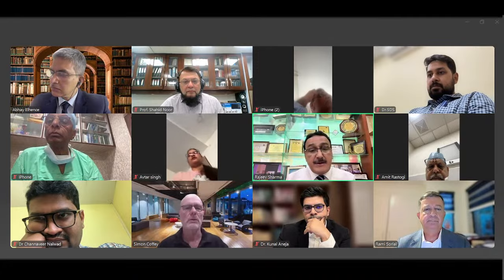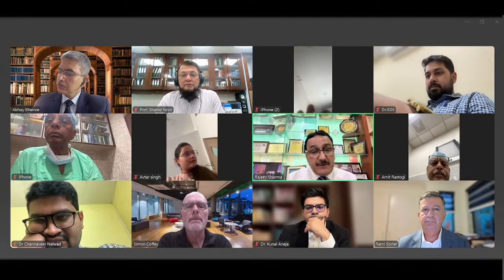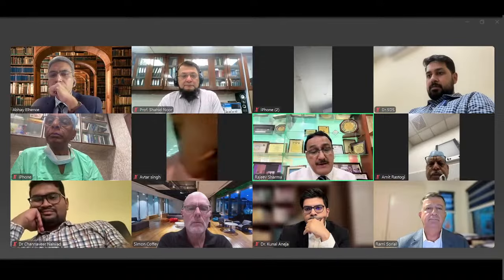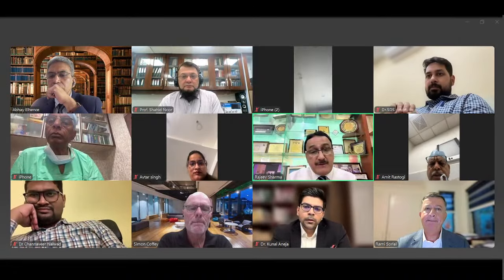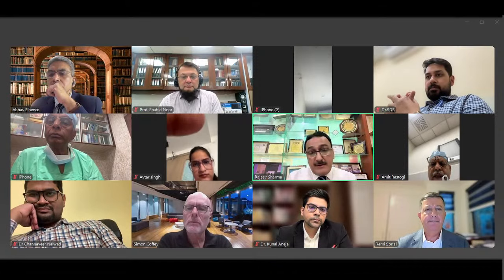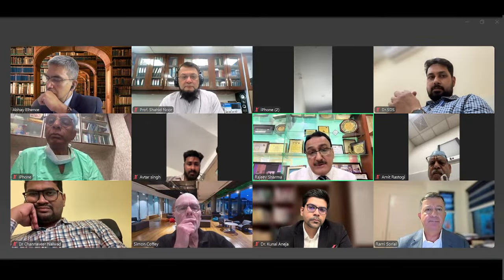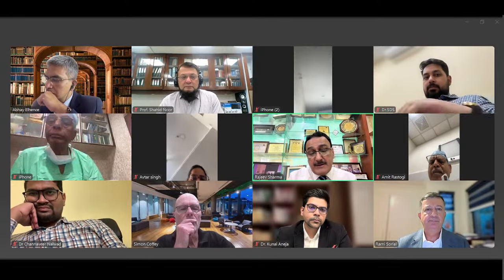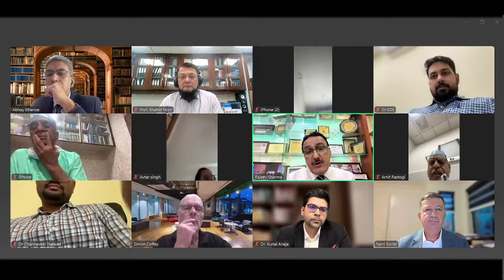Simon, that's a very important thing. We have been assessing and seeing the femoral offset frequently and measuring it up. The acetabular offset assessment is slightly more tricky because you need to have an assessment preoperatively, and perioperatively you need to have in mind the preoperative assessment. The right way could be that from the measurable fixed places, it will be the pubic symphysis. On an X-ray, if you measure from the pubic symphysis to the acetabular cup, the medial wall, you can see how much the cup is medialized or lateralized.